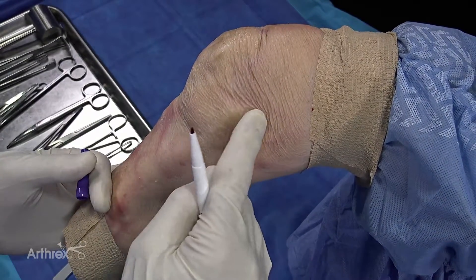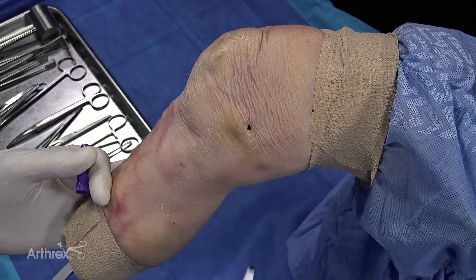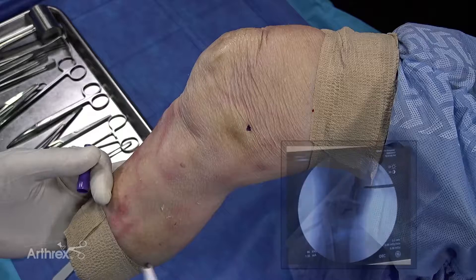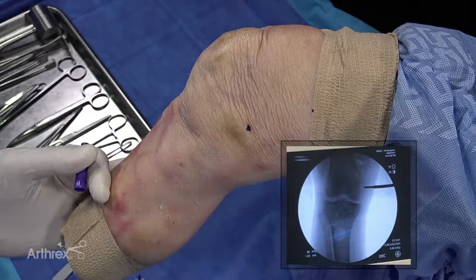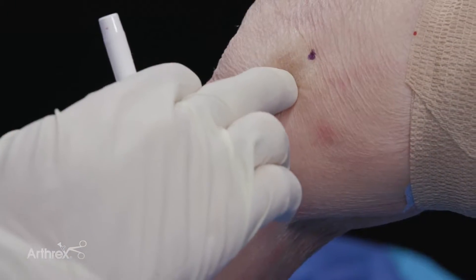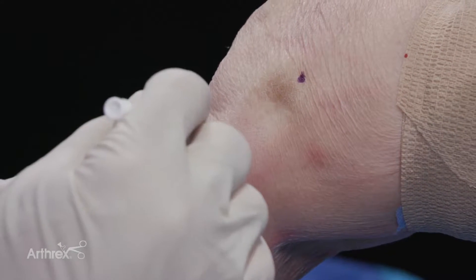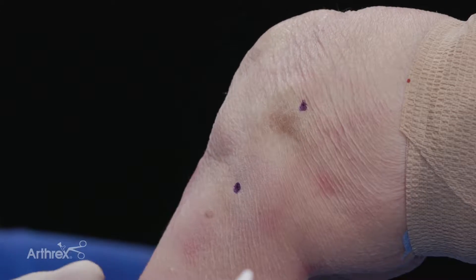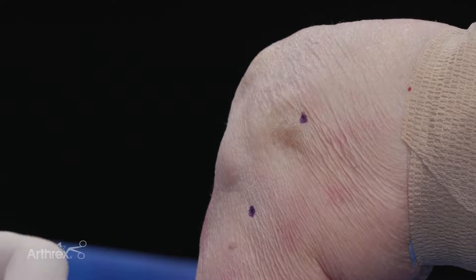The first thing you do is you mark out the medial epicondyle, or the origin of the MCL, which is right here. It's easily palpable. Typically in the OR, I'll use a fluoroscopic guide for my points. And then the joint line you can feel, and then two centimeters below the joint line is your second spot. And that's where we're going to do this percutaneous repair.